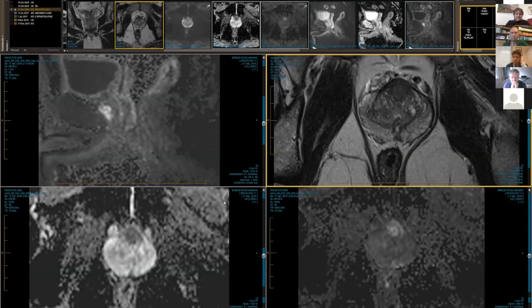For the anterior mapping, I think it's not too difficult. The best way is to go exactly at the level of the lesion, straight to the lesion, and not to force on the probe or with the needle to go anterior, starting from the posterior access point on the skin. So it's not too difficult to go anterior, but it needs expertise. Yep. Okay, thank you for that.